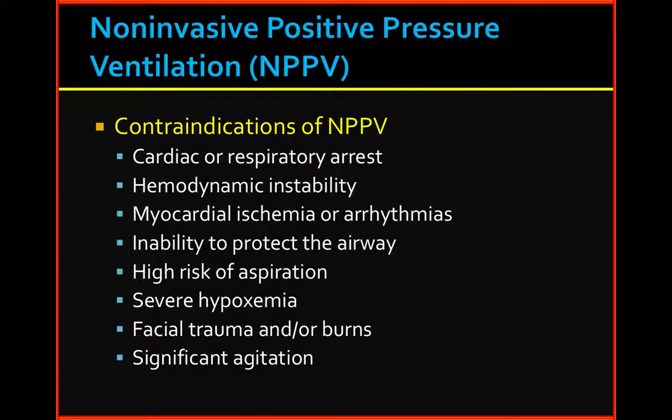But this is the basic anatomy of an endotracheal tube. Now, of course, we just talked about the ventilator. That's got a bunch of buttons and whistles and things we're going to talk about in a little bit. Okay, so going back to our patient again.